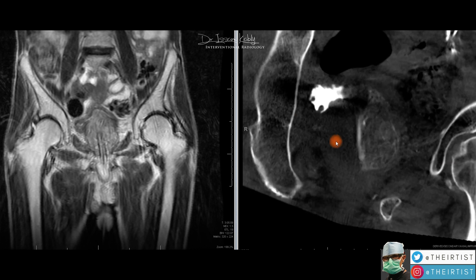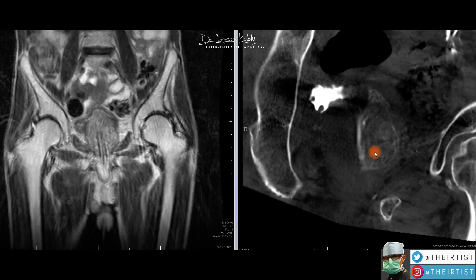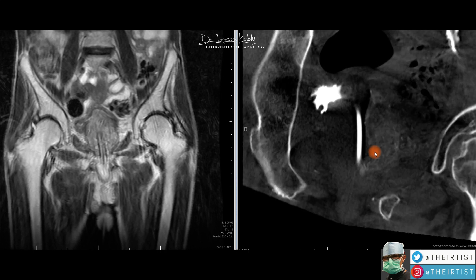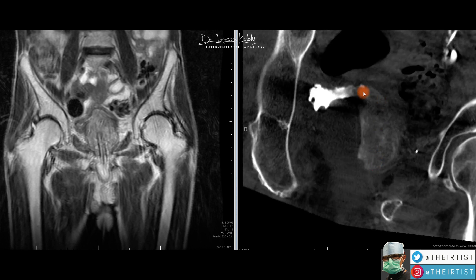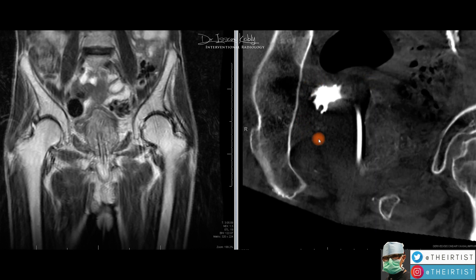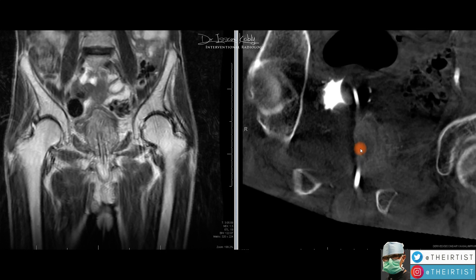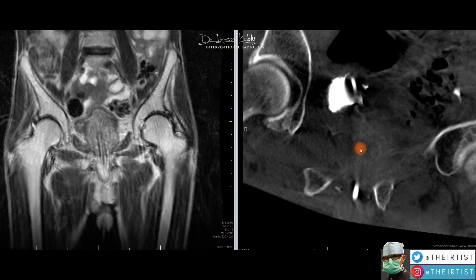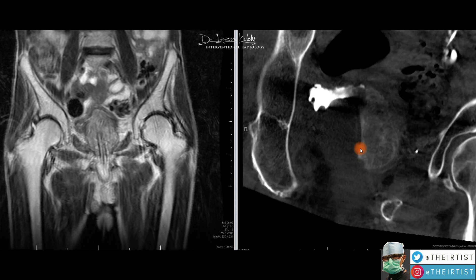In this case, the arteries don't communicate — the left lobe is totally independent from the right lobe. What happened here is we were only able to treat one lobe, the left lobe, because there were no visible arteries on the right side due to advanced atherosclerosis. We will see whether treating only one lobe is enough.